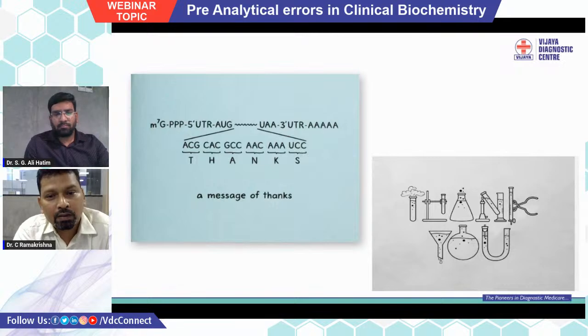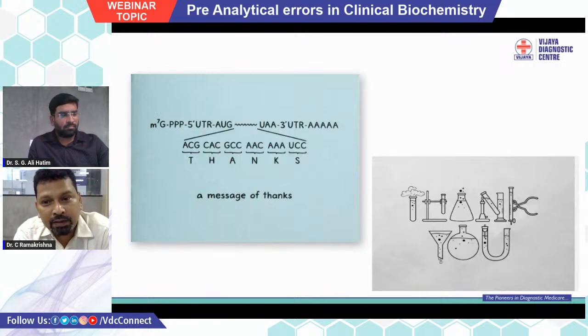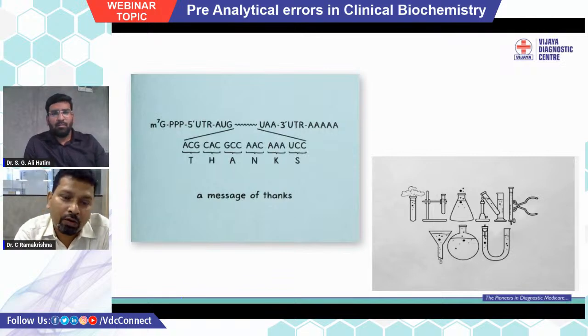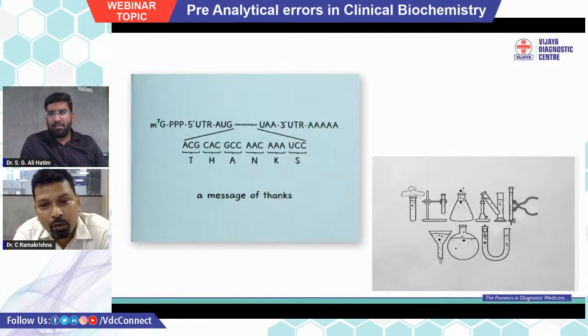Okay, so that is for today's session. I hope I was clear enough. It is a very small topic but very interesting, and it is very important because we get so many abnormal values and we don't know what to do. And if you just give a look at the sample, you can see clearly if it's lysed, icteric, or lipemic, right? So that is very important.